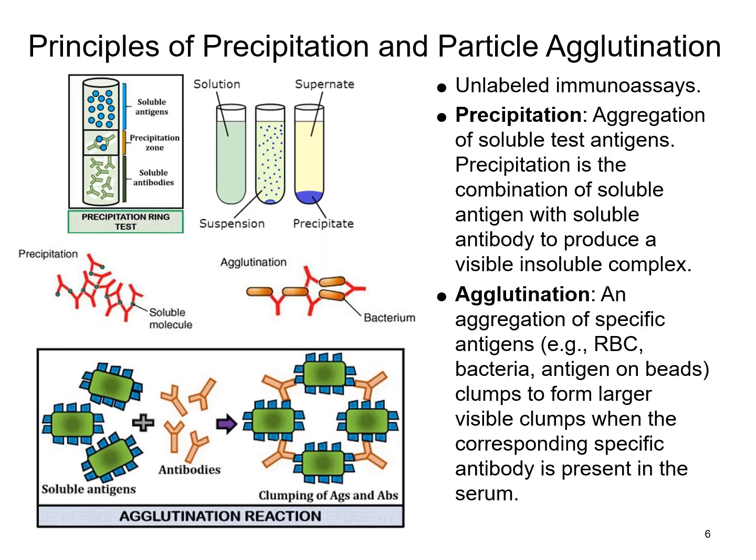Precipitation and agglutination is considered to be unlabeled immunoassays. And so basically the result is looking for the presence of that agglutination or aggregation of those antigens and antibodies to actually form and show that visual aggregation, versus where your labeled immunoassays are basically your antigen or antibody is tagged with something that's going to allow it to be detected in a different way. So this could be something like it being able to emit some sort of radiation, produce a color change, able to fluoresce or emit some sort of light signal. So with the unlabeled, you're just looking for that clumping, agglutination, precipitation that's taken place.